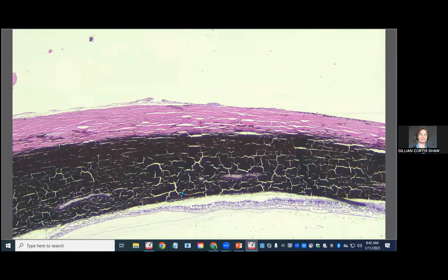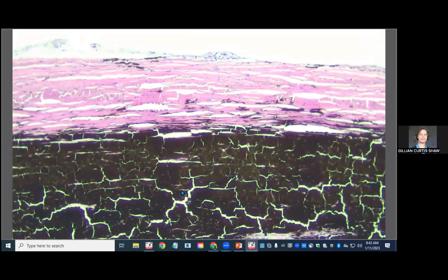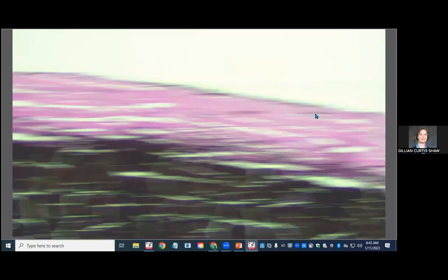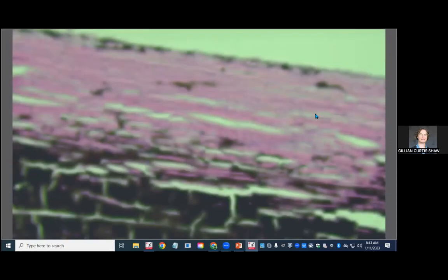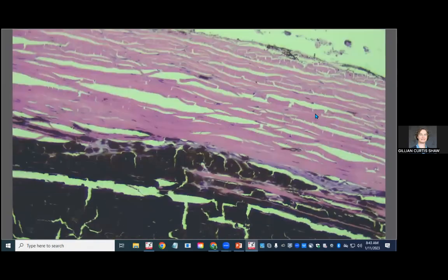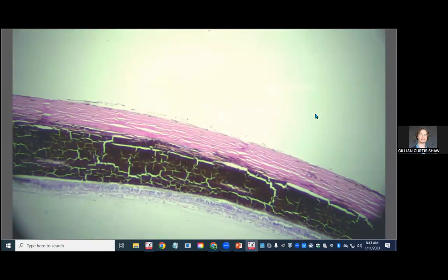The sclera itself also, and here we're more in the equatorial sclera, but the equatorial sclera also has a larger number of these fairly bland looking cells. At this mag, all you can say is that there's pigment there, but we just assume that it's inside of cells. So we have a lot of melanocytes populating pretty much every single tissue that we've sampled in this eye.